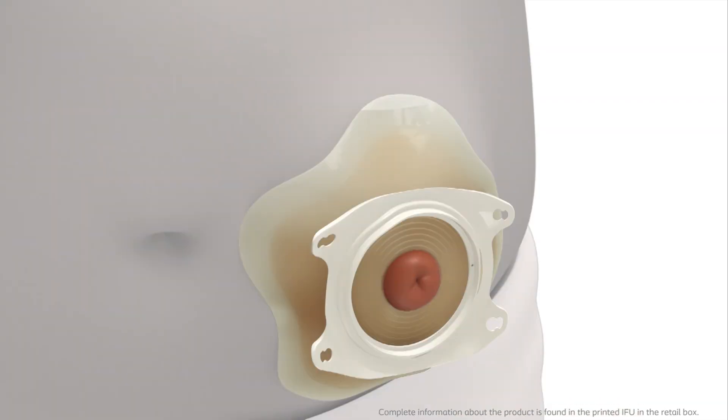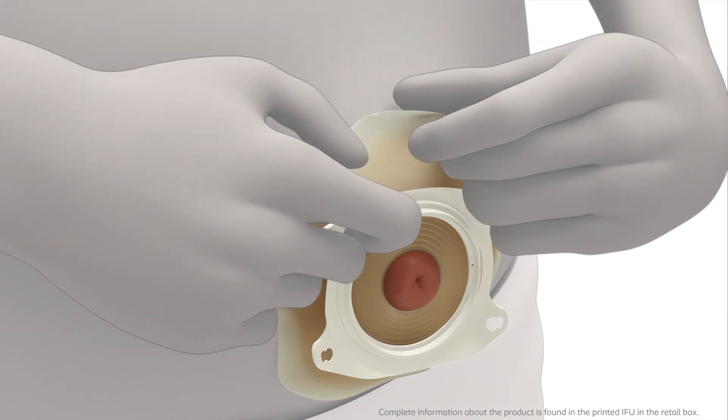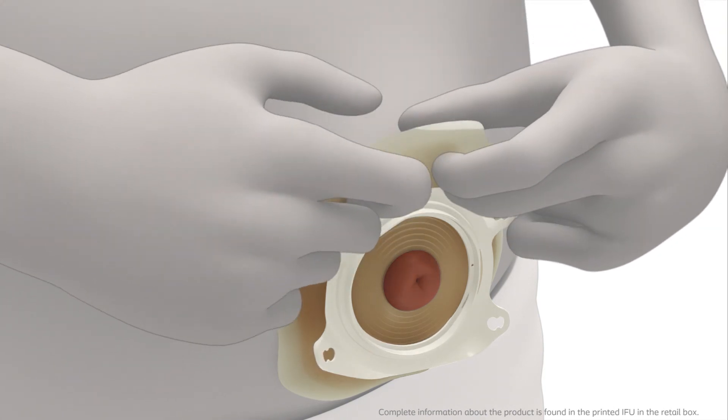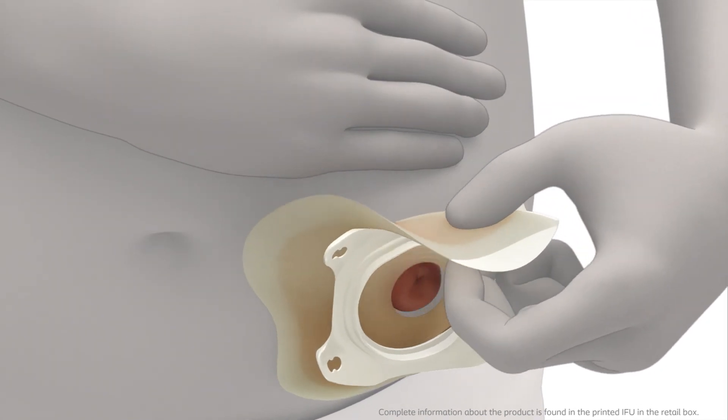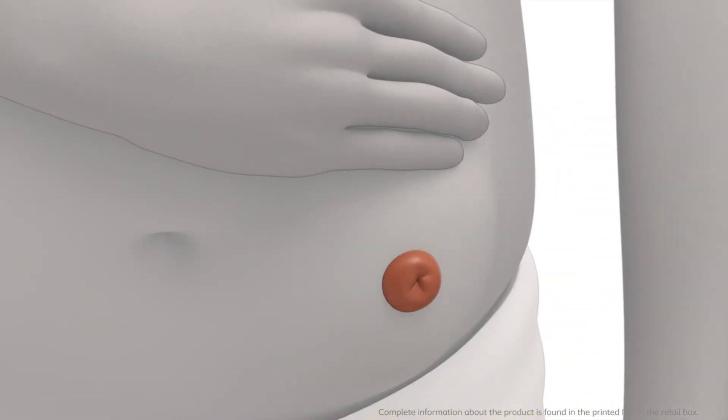Gently remove the base plate by pulling the removal ear on the adhesive away from the stomach and roll the adhesive slowly downwards. Apply light pressure on your skin with your free hand to help removal.